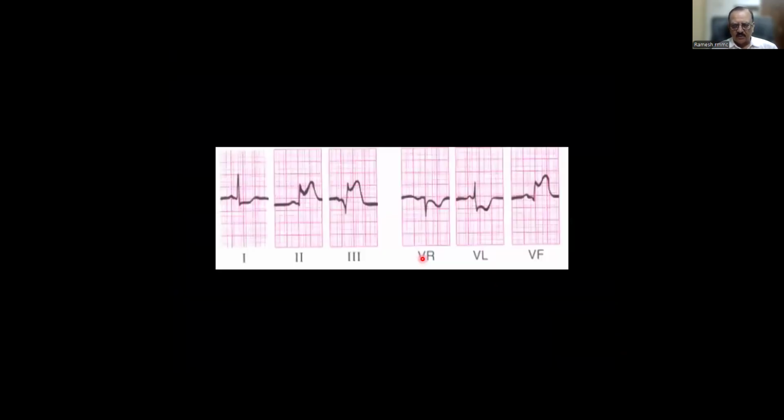Good. All of you have made very good observations. What is this ECG? Is it normal or abnormal? What is the abnormality? Emergency or not? Admit or not? Where is the lesion? Which coronary artery is diseased? Elevation in 2, 3 and aVF. Yes. It shows hyperacute inferior wall changes. Excellent. Hyperacute inferior wall MI with some lateral wall changes.